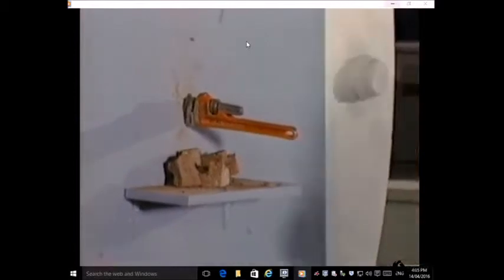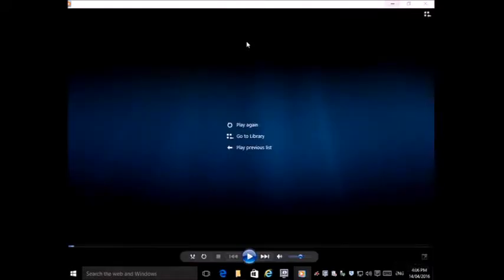And this would be a 1.5 Tesla scanner. As I said, most of them that are installed now are 3 Tesla. So essentially, if you had a speed gun and a device like that and let it go near the patient's foot, it'll shoot into the magnet. By the time it gets into the centre of the magnet, it'll be travelling somewhere around 60 kilometres an hour. There have been a few recorded deaths overseas where people have taken the wrong sort of device into a scanner.